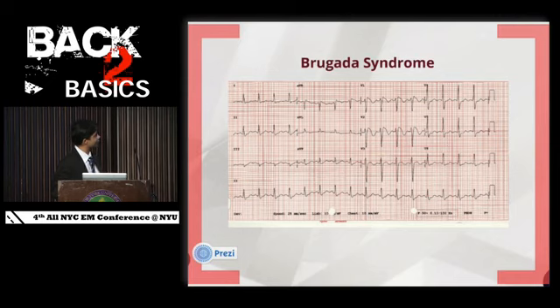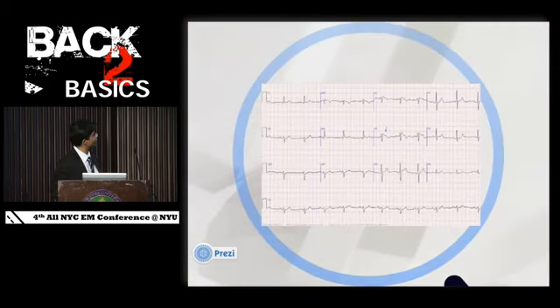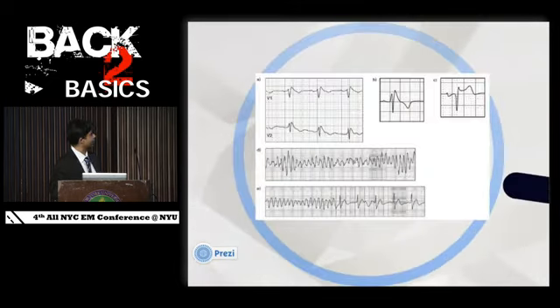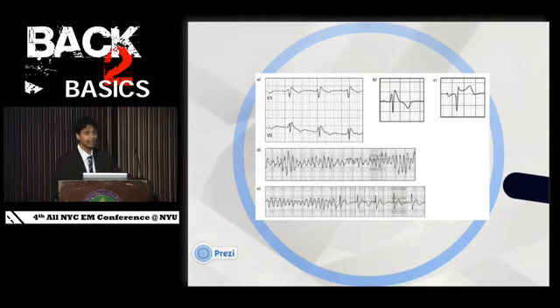Here's another example. It's this saddleback type deformity. Here's some more pictures. This is what Brugada syndrome looks like, and again, you can get a polymorphic VT, and it's usually transient, but these guys will do well if you tell a cardiologist, and they'll end up getting a defibrillator.